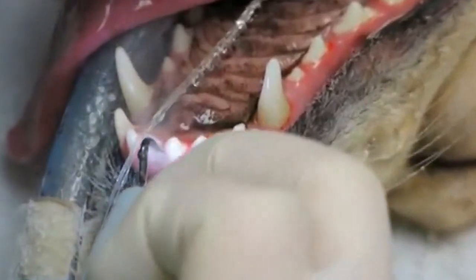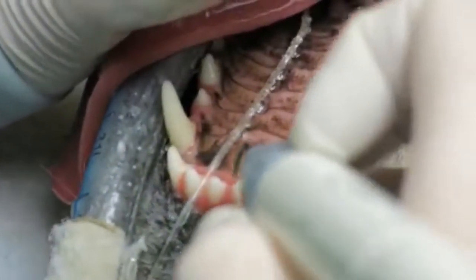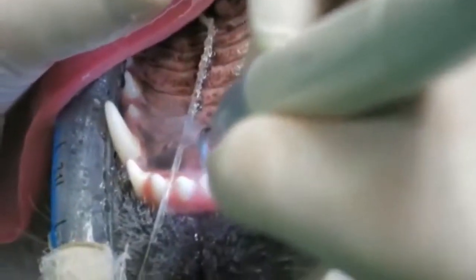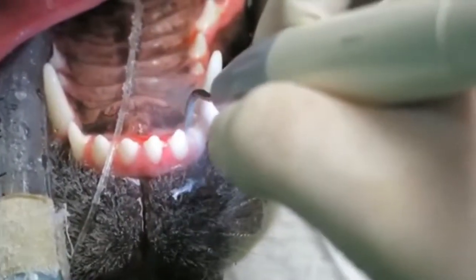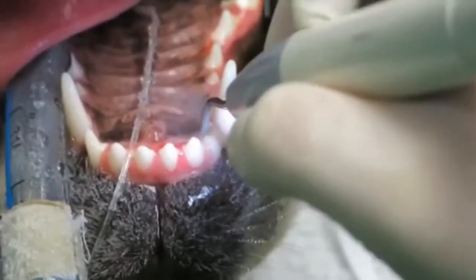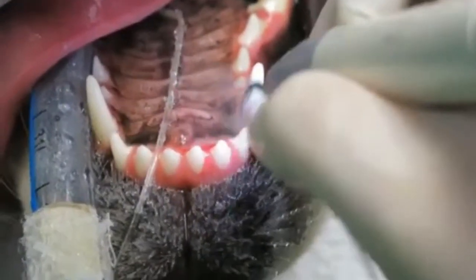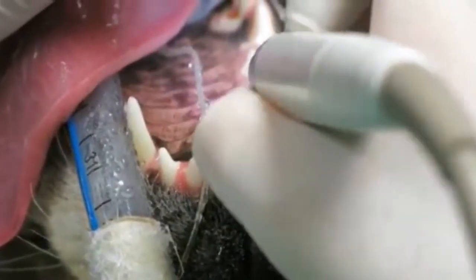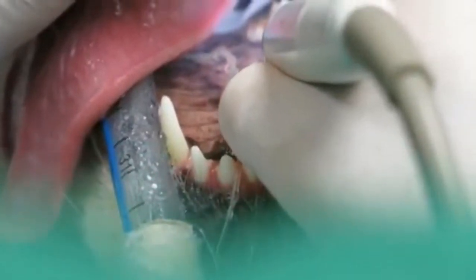There's a vibration at the tip of this ultrasonic scaler and it gets very, very hot. So it's important for it to get cooled by the water. This is distilled water, so it's very clean. We don't use tap water.